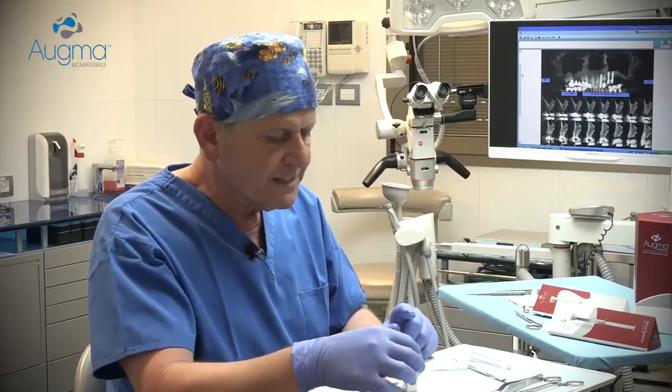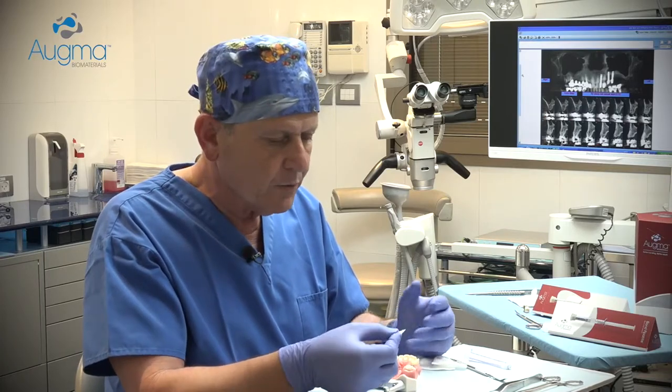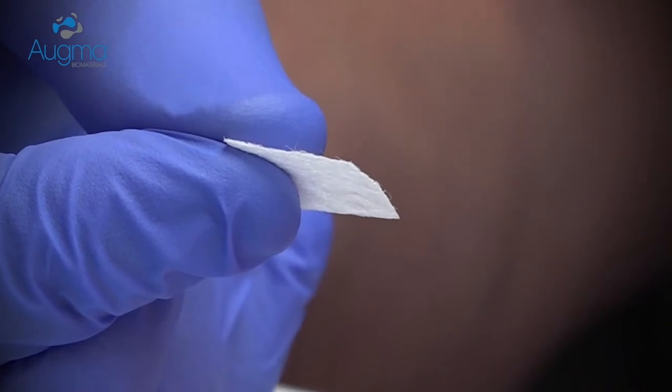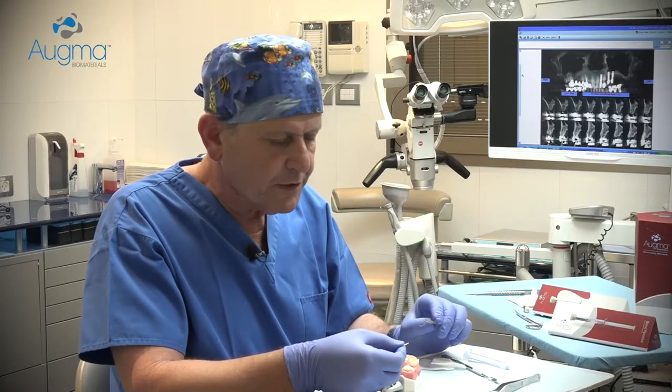Now you cannot leave the material exposed. What you need to do is take a barrier, which can be a simple collagen sponge, and place it above the graft. However, it must be sutured together with the soft tissue.